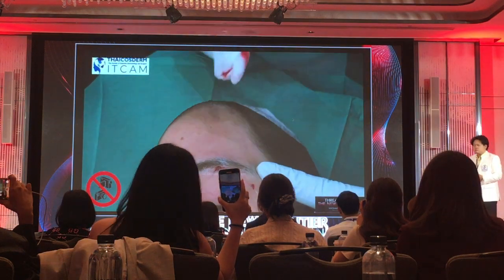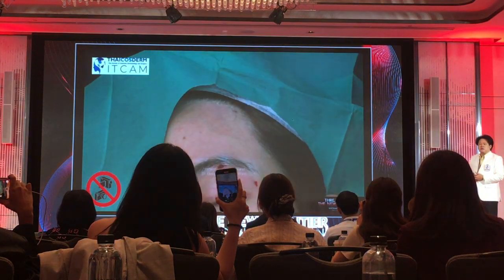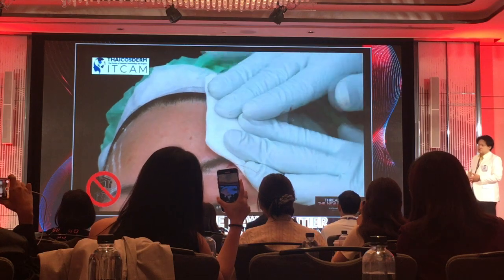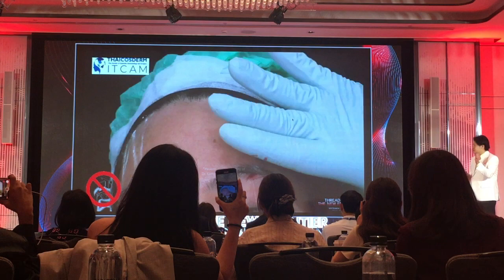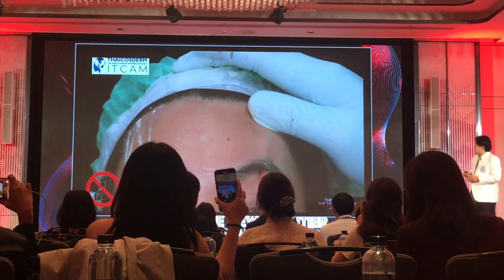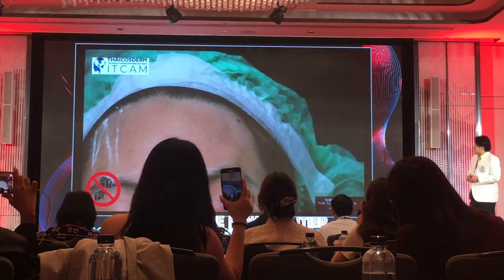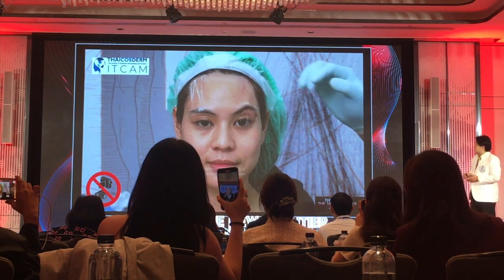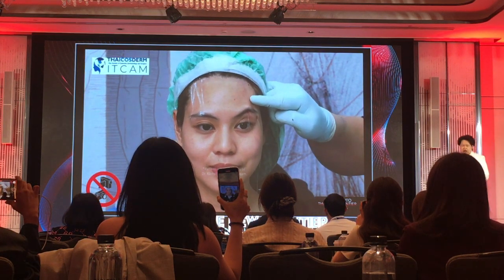And how to traction? I would traction just only the skin. I would not traction the thread. So you need to make a compression for about 2-3 minutes to stop bleeding. But normally it's only a little bit of bleeding. Now I open the arm and lift the eyebrow up. You will see that the thread is hooked with the orbital retaining ligament. And you can compare between the left and right, before and after. You will see that it's totally high.